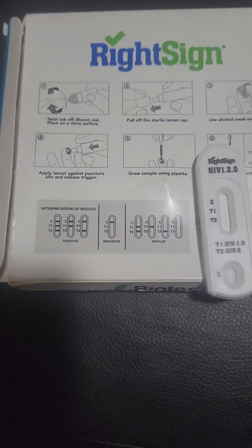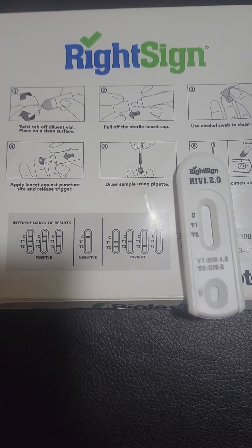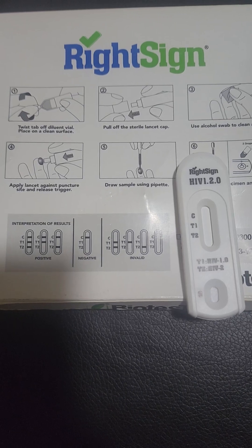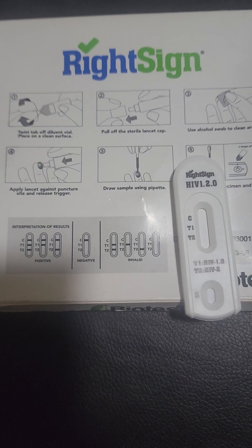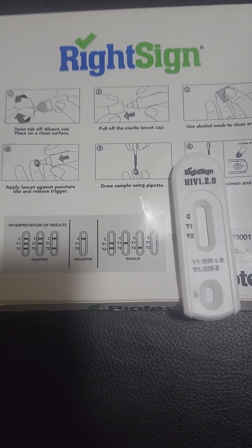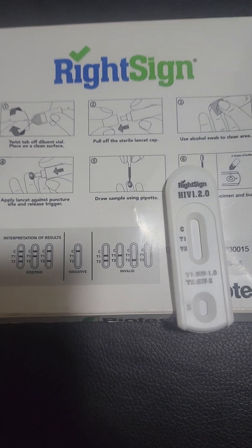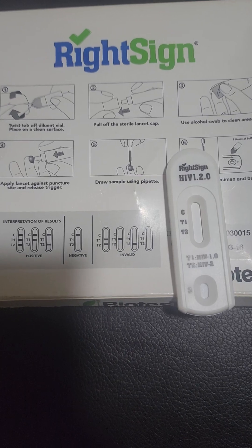If the test is invalid, the control line C will not be activated. If there is indication on T1 or T2 but no control line, or there is no indication at all, then the test is invalid and you will have to redo another test or alternatively do a full blood test.